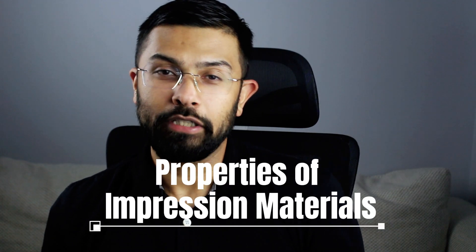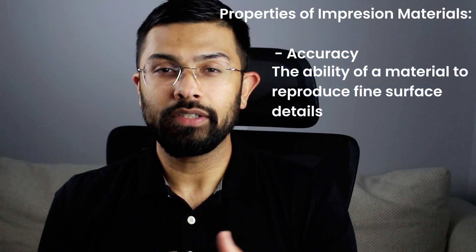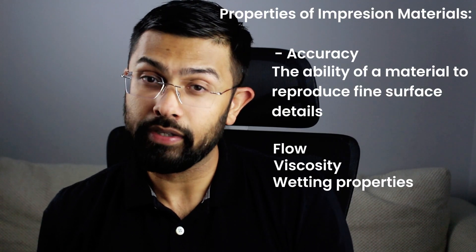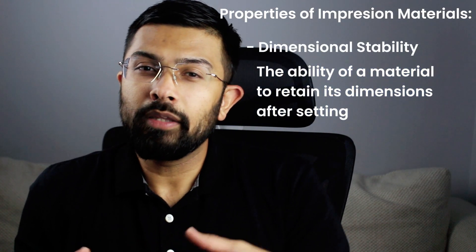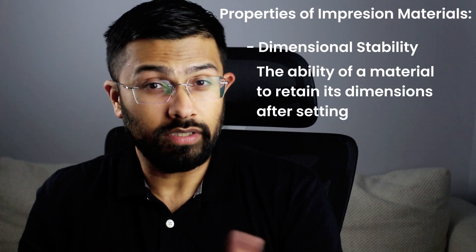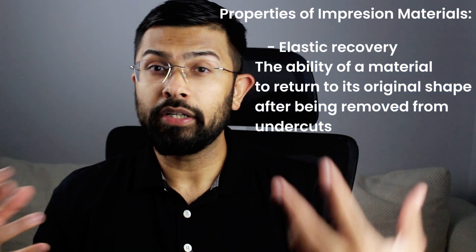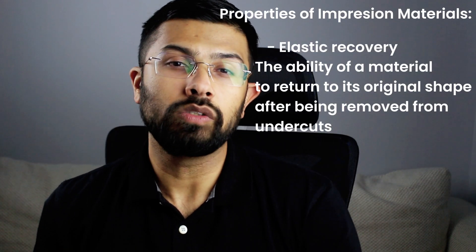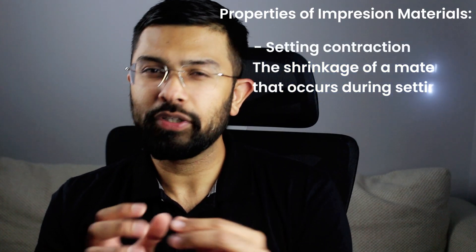Now let's talk about the properties of impression materials. The first is accuracy — the ability of the material to reproduce fine surface details, which depends on its flow, viscosity, and wetting properties. Higher accuracy is crucial in fixed prosthodontics like crowns and bridges. Dimensional stability refers to how well the material retains its dimensions after setting. Materials like alginate tend to shrink due to water loss, which is called syneresis, while silicones remain stable for longer. Elastic recovery is also important: after being removed from undercuts, the material must bounce back to its original shape without distortion. Polyethers and addition silicones have excellent recovery. Setting contraction is another property — polymerizing materials like silicones undergo slight shrinkage during setting, which can compromise fit if not compensated by proper technique or tray selection.